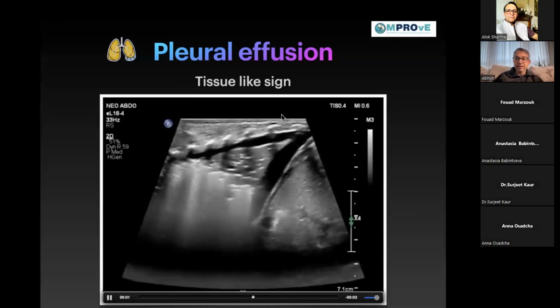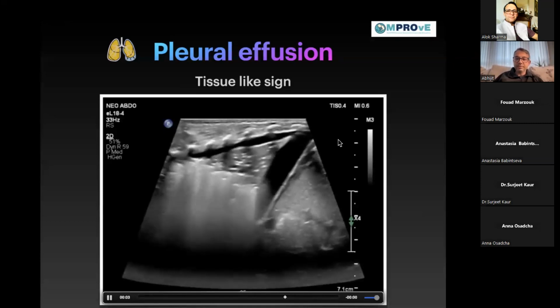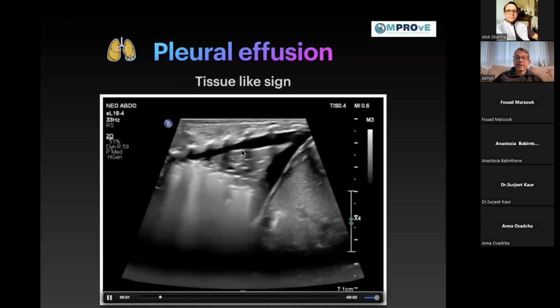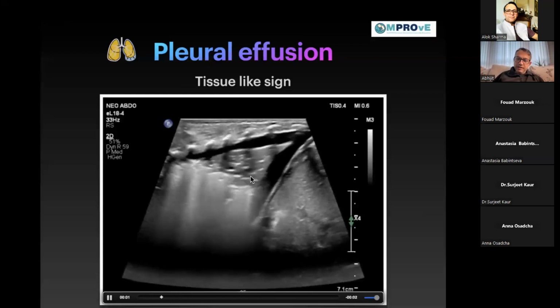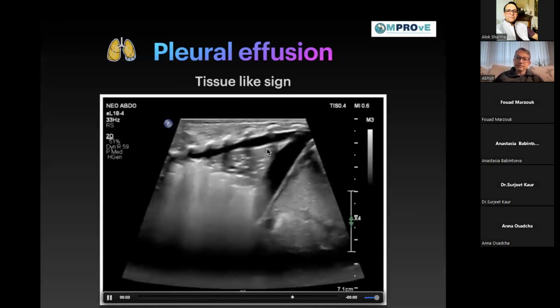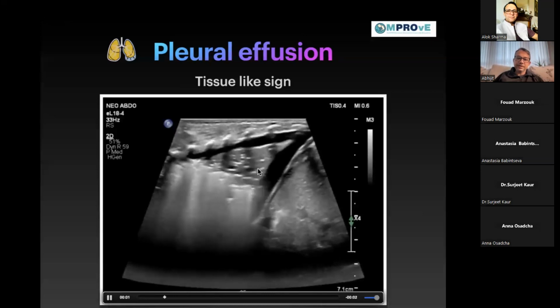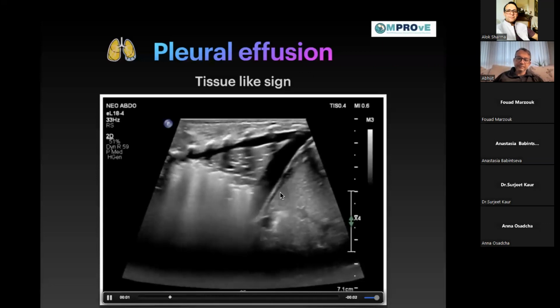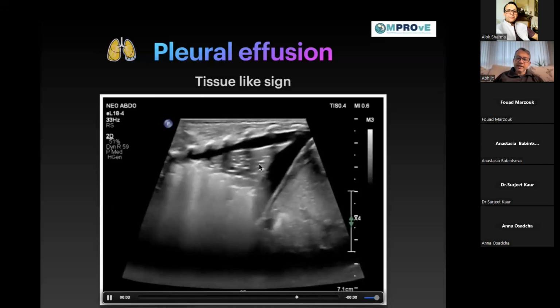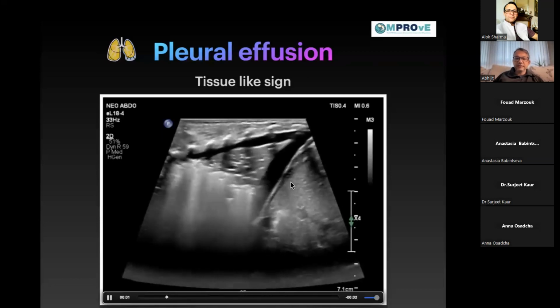Now, this is a preterm baby. You can look at the entire lung in one picture. So it looks a bit different, but that's the jellyfish. Now, on the same picture, you can see that lobe of lung, isn't it? And it looks more like this. Now, this is your liver. That's your diaphragm, that's your liver, and your lung looks more like liver.